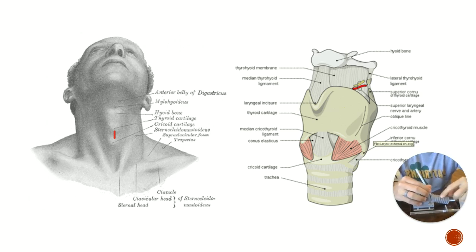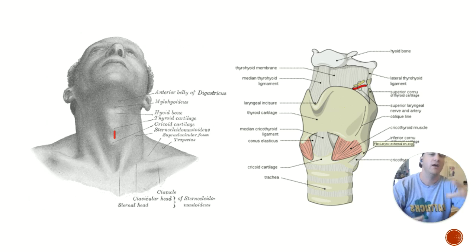You might even feel the cricothyroid rings. And then this is your cric kit, or if you take a 6.0 ET tube, you're going to feed it over, blow it up, bougie out, end tidal CO2 on, bag the patient, confirm you have color change on your end tidal colorimetric device, or you have an EMMA, which is an end tidal CO2 capnography. It's like a finger pulse ox, but it's end tidal for your ET tube. And that's how you do a cric.